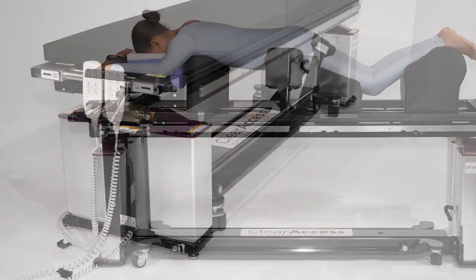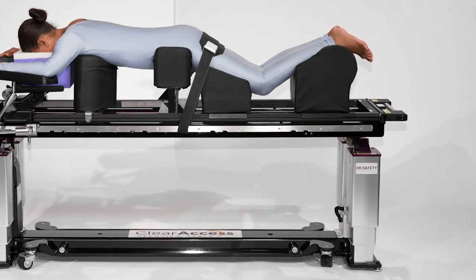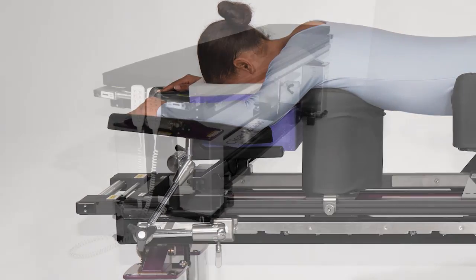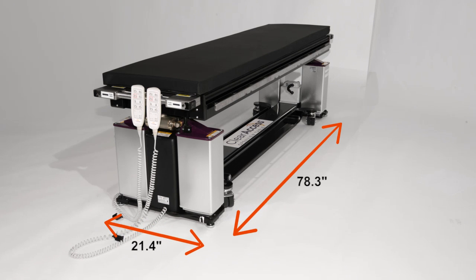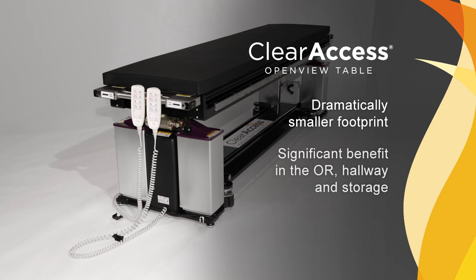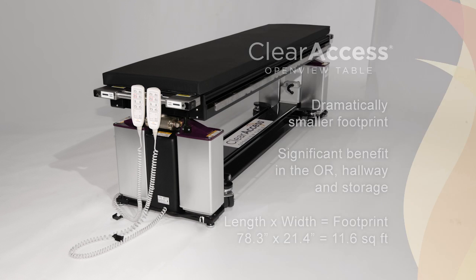Without outboard wheels, the table allows shoulder-to-shoulder docking with the gurney, which facilitates safe patient transfer onto and off of the operating platform. And perhaps most notably, there are no towers at the head or foot end, completely removing the need for T-pins and allowing anesthesia direct access to the patient's head and airway. Without outboard wheels and towers, the Clear Access table has a dramatically smaller footprint than competitive systems. Jackson-style tables commonly occupy more than 26 square feet of space, while the Clear Access footprint is less than 12 square feet.